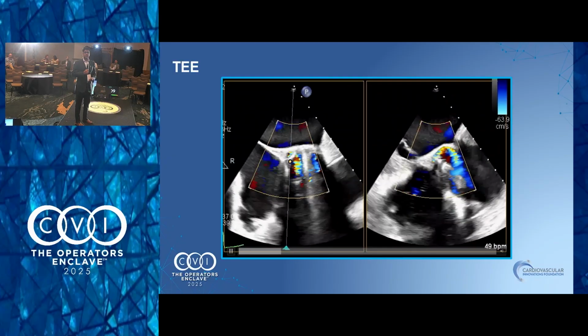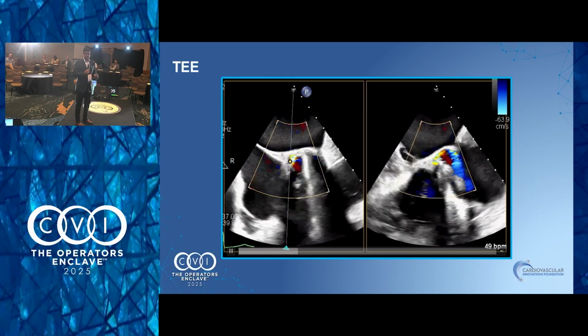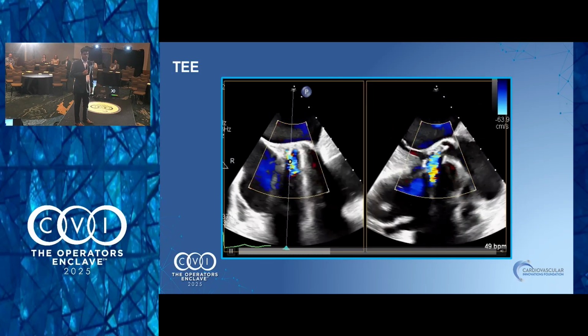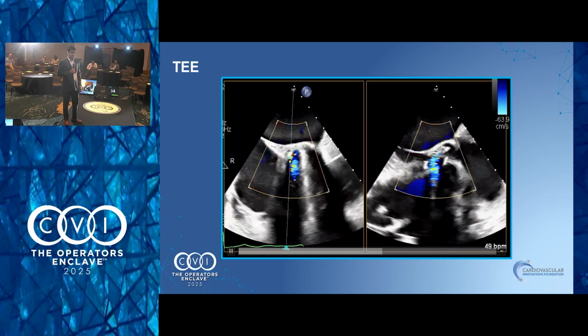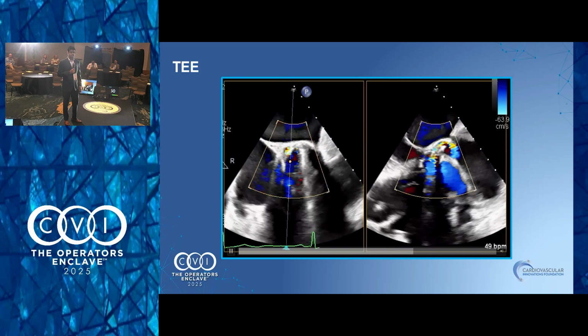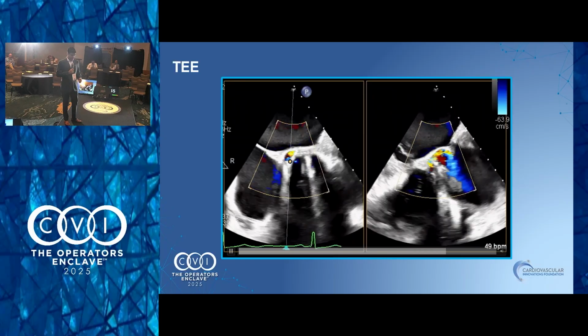Basically, is this PVL? Is this aortic? One of the things about aortic was this is a Bentall. How would you leak around a Bentall from an aortic PVL? So that's what I did not think that way. But if that's pulsatility into that pseudoaneurysm, I would be inclined to close this. It just looks quite ominous, and it's a big sac already. It's a big sac, yeah.